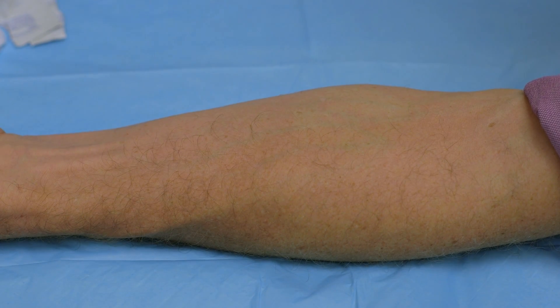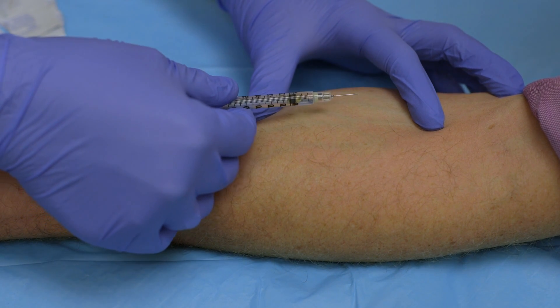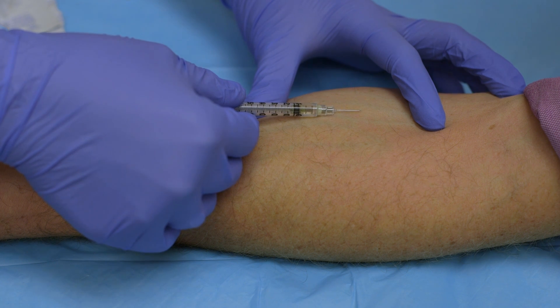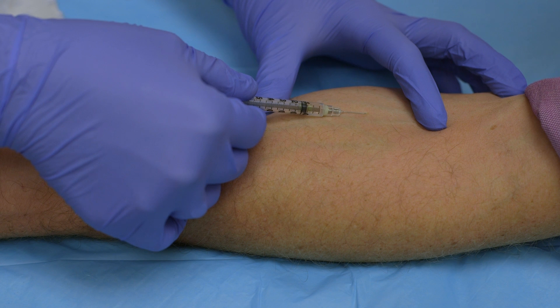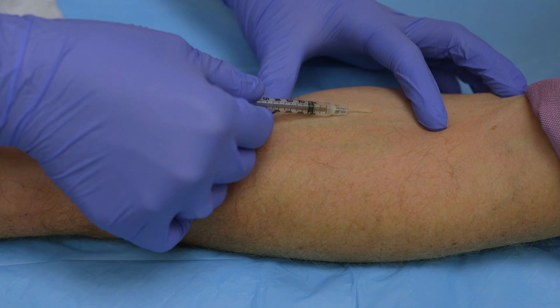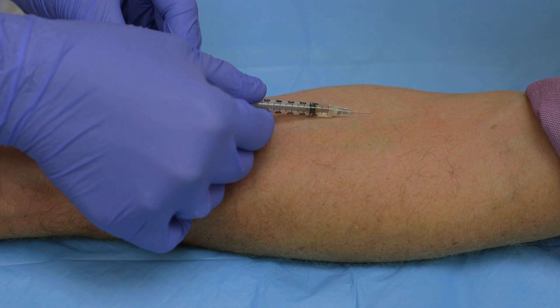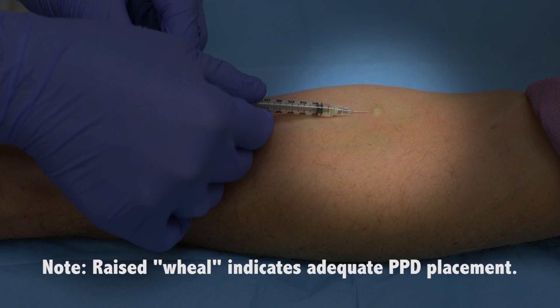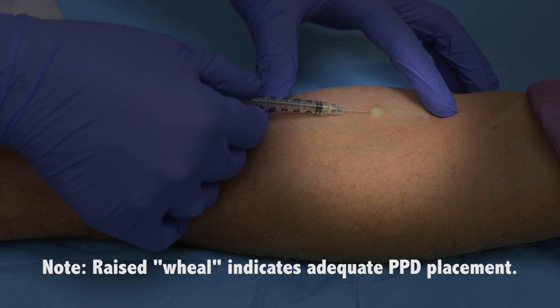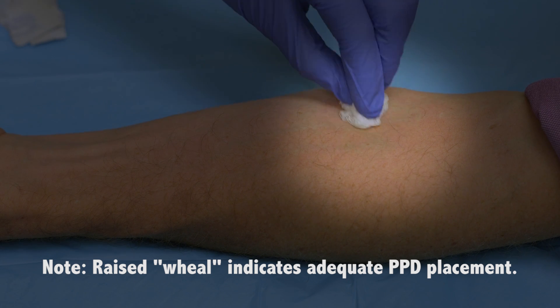Go ahead and get your needle, make sure it's facing bevel up. Pull the skin tight again and make sure you're only at a 10 degree angle. Inject right underneath the skin. Take your other hand and go ahead and inject the medication. You'll see a wheal pop up — that should be about 6 to 10 millimeters. Go ahead and take the needle out. If there's any blood you can wipe it with a gauze, but do not place a band-aid over it.